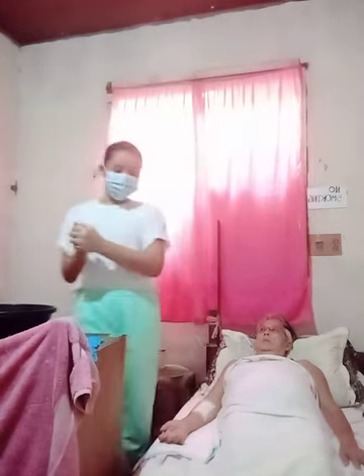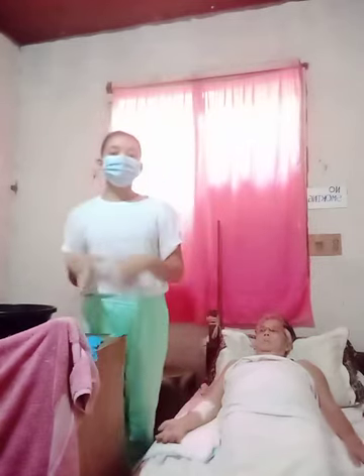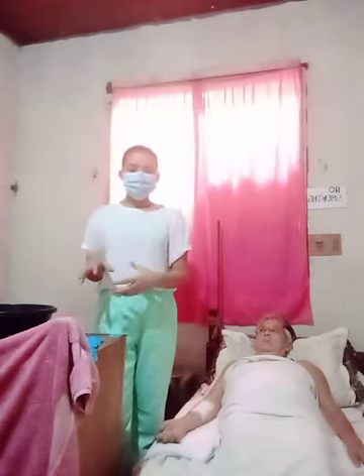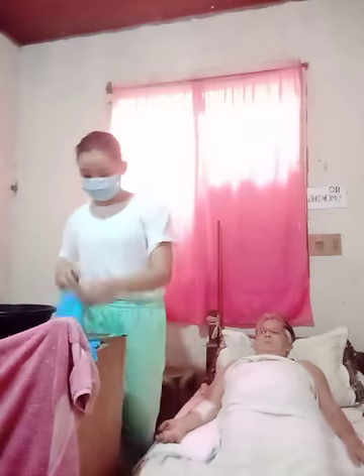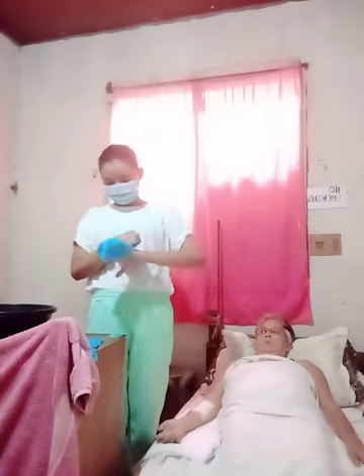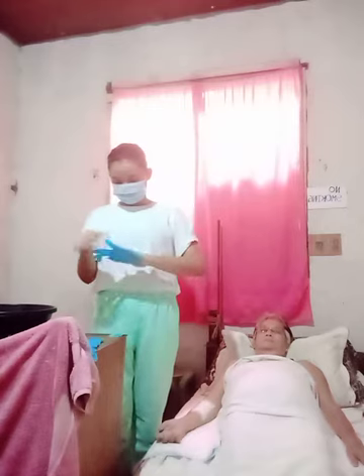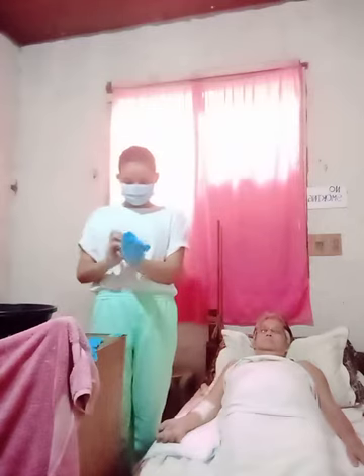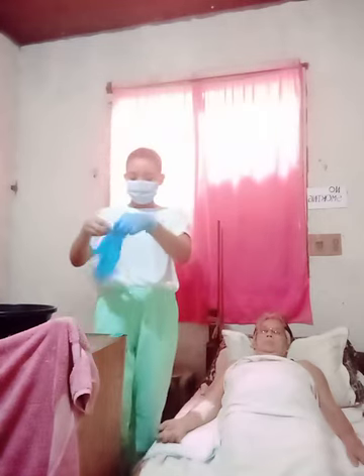After that, dry your hands, then put on clean disposable gloves. Actually, these are the clean gloves.